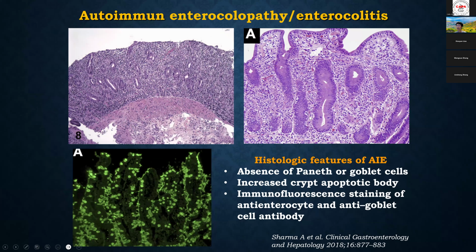So how do we make a diagnosis? You need to take the patient's serum, which is supposed to have antibodies, and then you incubate it with normal colonic mucosa or small bowel mucosa containing goblet cells. And then you use an immunofluorescent-labeled second antibody, and you can highlight goblet cells. That's the diagnosis for this entity, autoimmune.